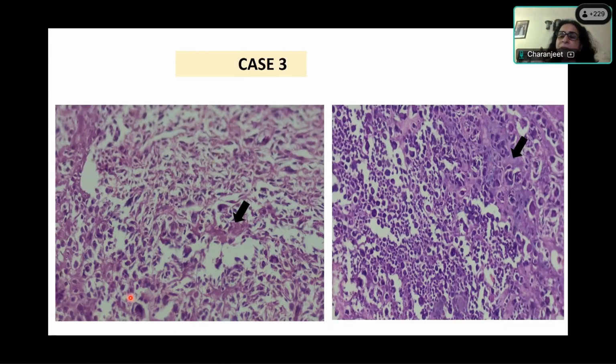Good, people are answering in the chat box. So this is a tumor wherein, as you described, it is cellular, with spindle cells, and at places it looks like there are fascicles. You are seeing marked pleomorphism, cartilaginous areas, and osteoid also. So now, Dr. Jasleen, your differentials, please.